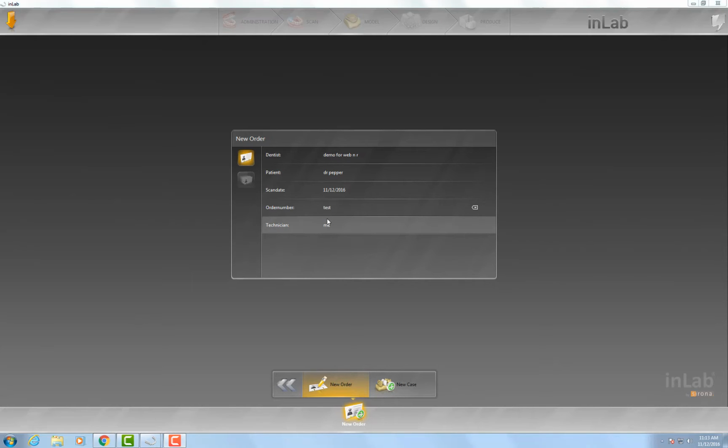It's not the fact that we're fixed, removable, implants, or ortho. BNR Dental Lab is unionized as a whole. And the one thing that has really implemented this unity is this IPF software along with implants, fixed, ortho, etc.